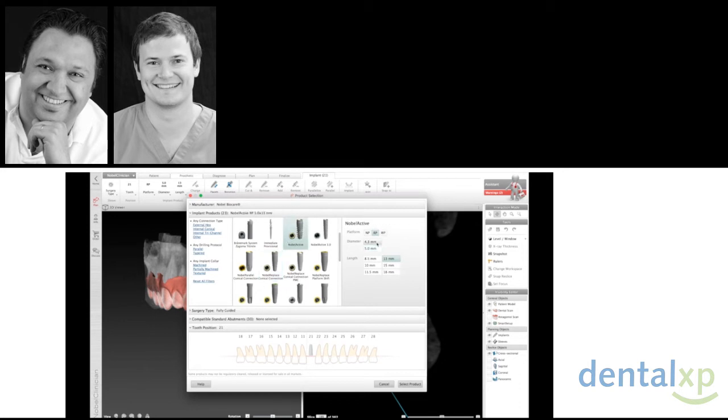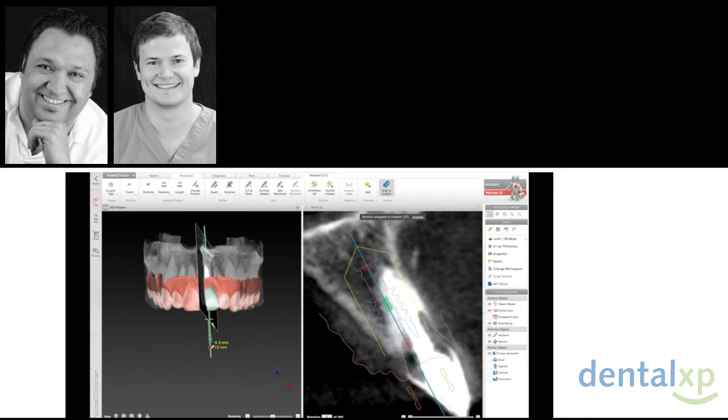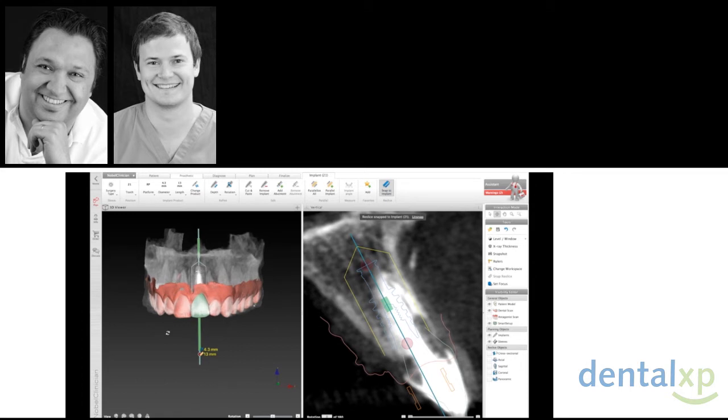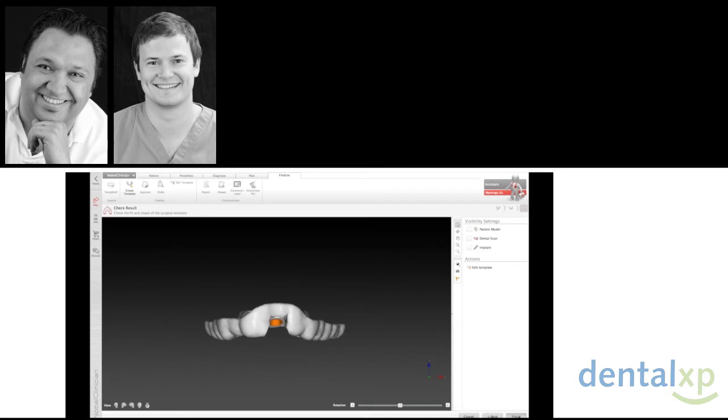And this is very important because right now we are preparing for the surgery, and it's important to place the implant exactly where we want in terms of emergence profile, and in terms of having a screw access that is palatal, of course. We want to use the most of the bone volume to be able to achieve good primary stability. So it's very important to take some time at this point of the planning. And then we ask for the guide.